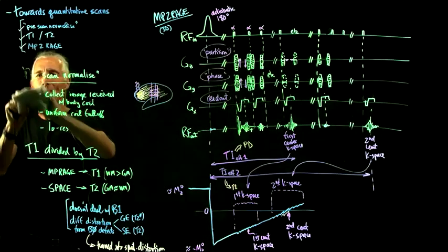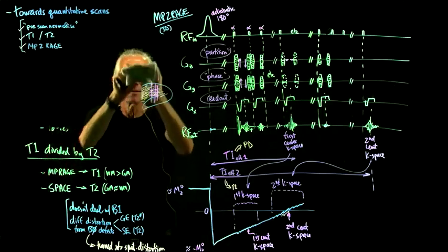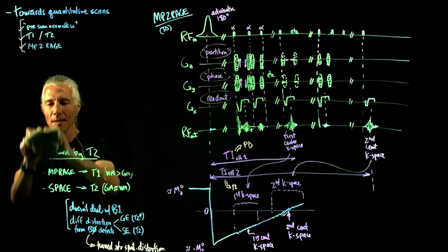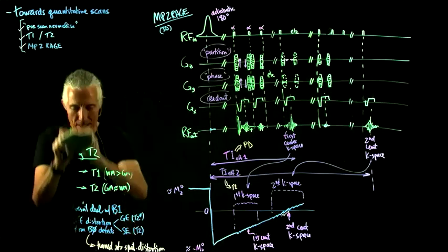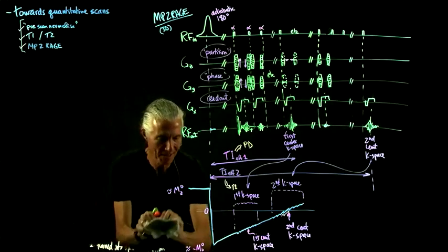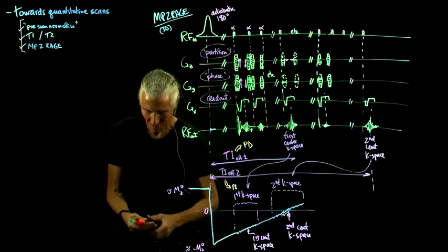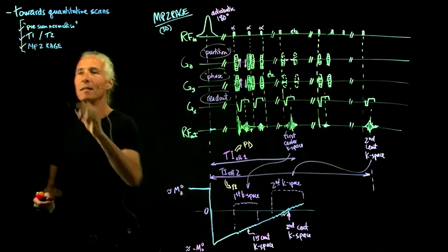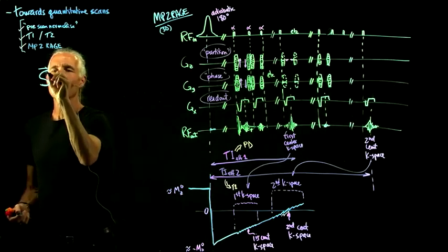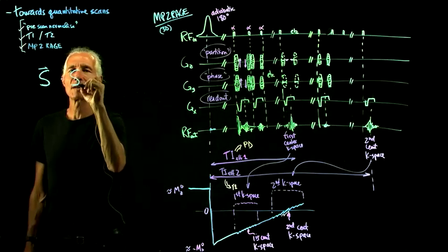So what do we do with these two complete images? You can just do a quick and dirty divide, but it's a complex value divide because we've got complex data. If you want to get a number that's between like minus 0.5 and 0.5, we could multiply these two complex numbers by each other.